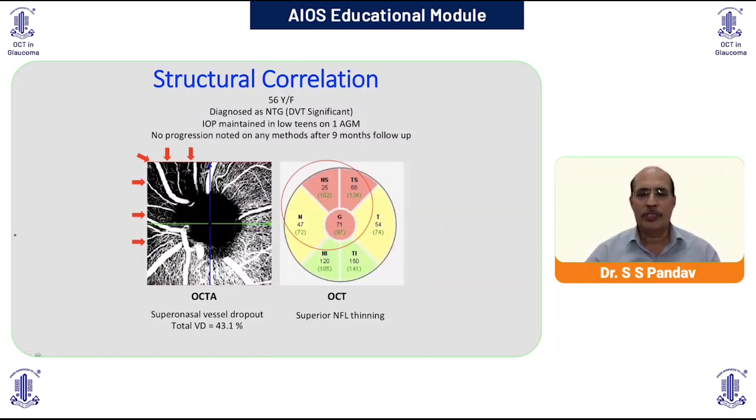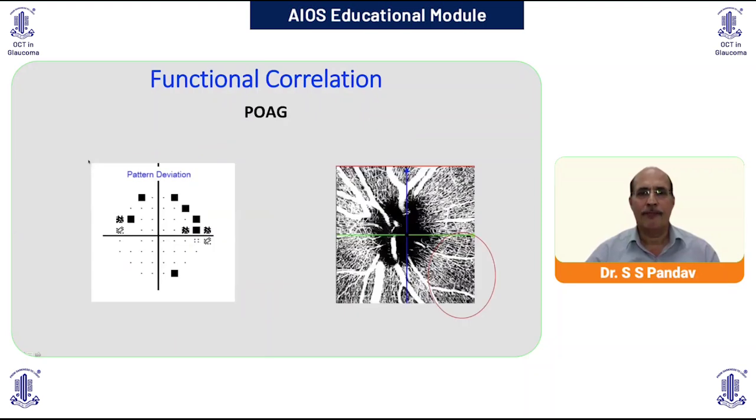If you look at the OCT nerve fiber layer projections here, this also suggests that in the corresponding same area the nerve fiber layer is thinned out. So the two are correlating, and that gives you confidence that what you are looking at is the same thing: a pathology detected in OCT is also corroborated by the OCTA, with a vascular decline in that area as well.